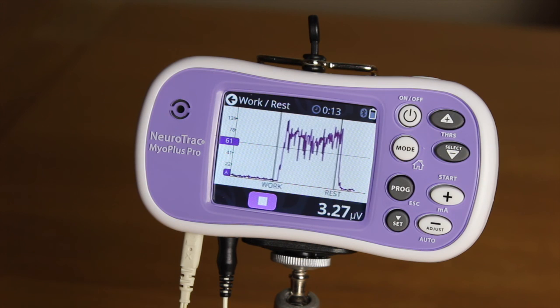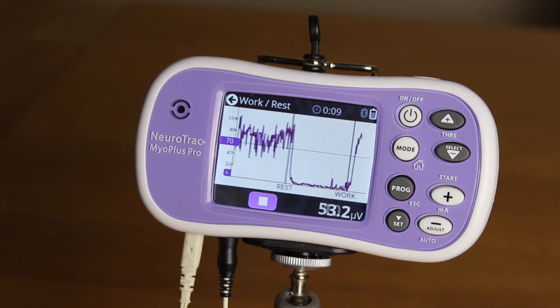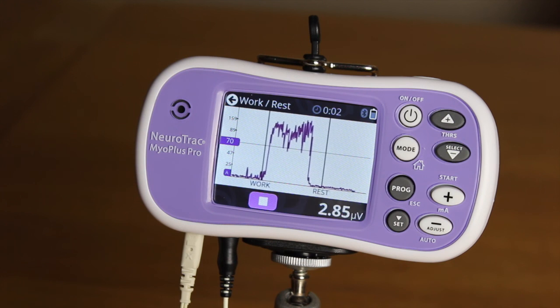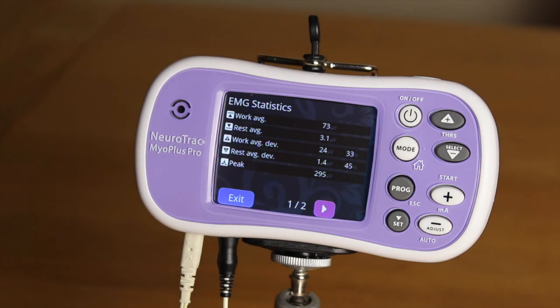The aim is to go above the threshold level during each maximum contraction and to release below 4 microvolts. At the end of the assessment, the EMG statistics are displayed on the screen. Over a period of time, the work-rest assessments can be repeated as the muscle becomes stronger and fitter. This can be really encouraging and a strong motivating tool as statistics improve.